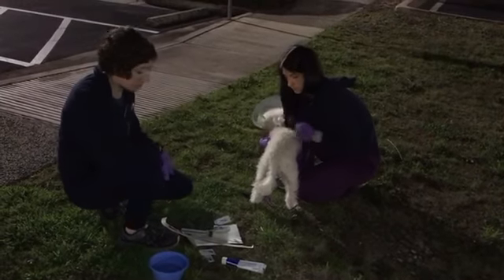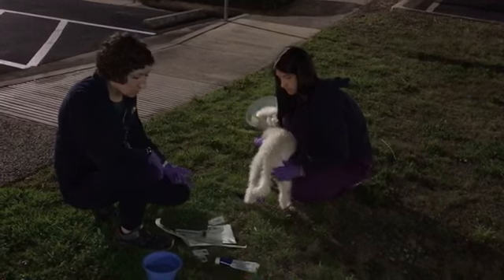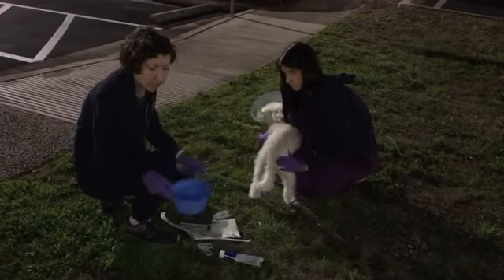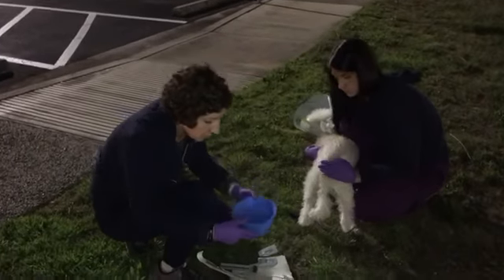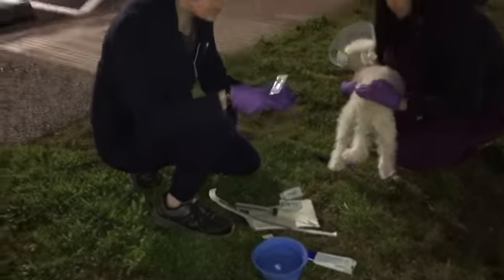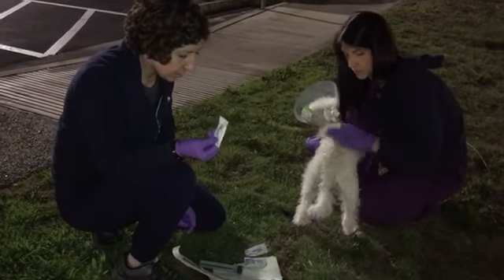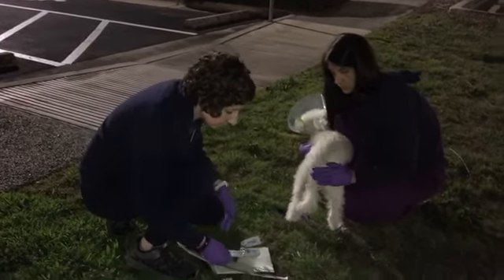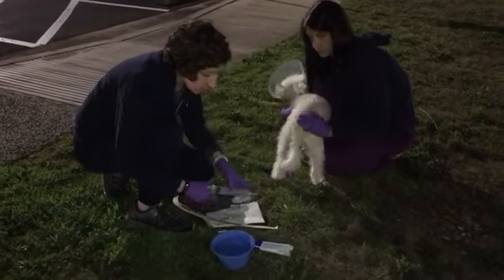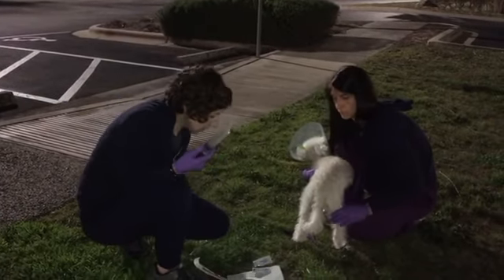Okay, so today what we're going to do is we're going to perform an enema on this dog. So the first thing we did was we mixed some warm water, not hot, but some warm water, and we mixed it with some sterile lubricating jelly. And the doctor wanted kind of a 1-in-1 ratio, so about half jelly, half water. So we mixed that in here. We drew it up. We're going to give a 60 milliliter enema.